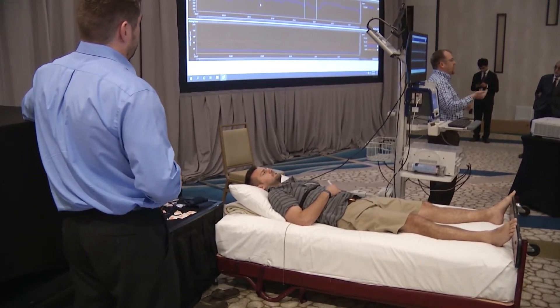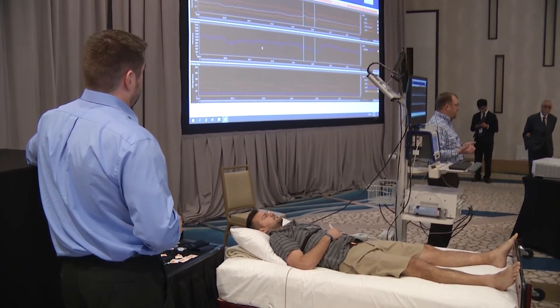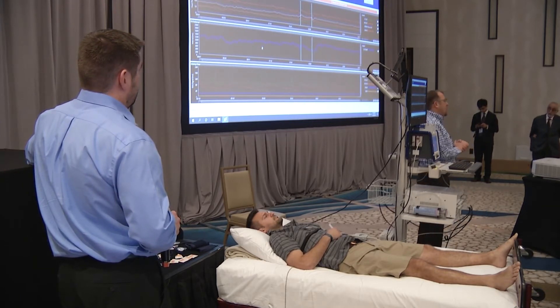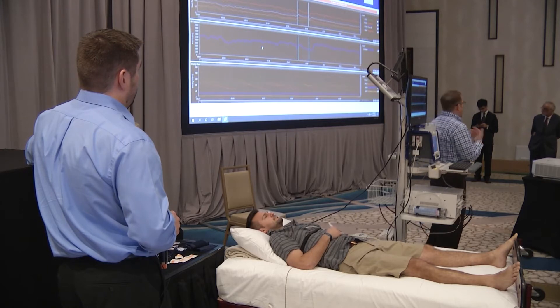If for any reason they couldn't maintain 40, this is when we would say on the next one just go to 30 and hold it there. There are settings you can change within the software. But normally we don't have the luxury of all these nice automatic markings, so we make them ourselves.